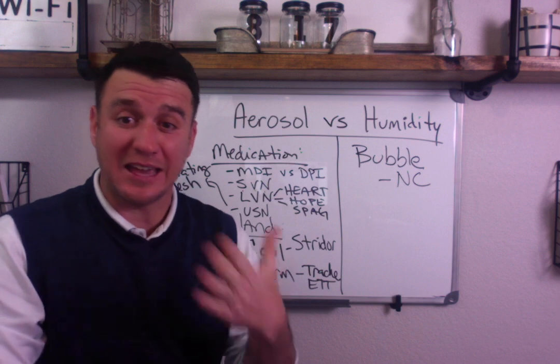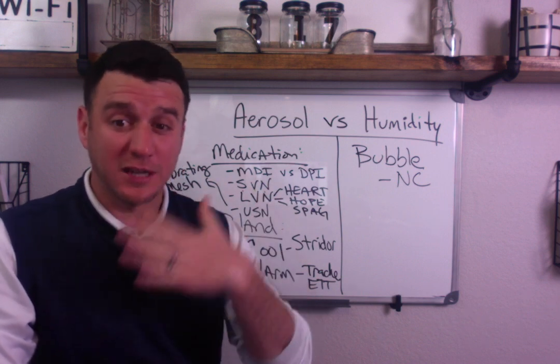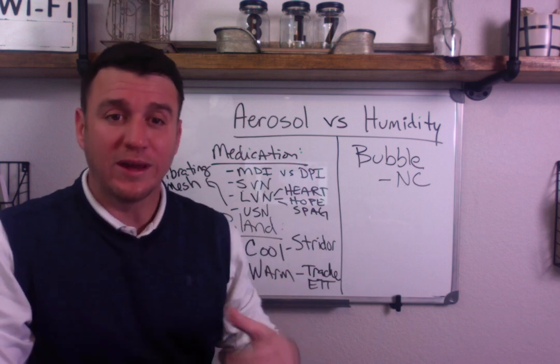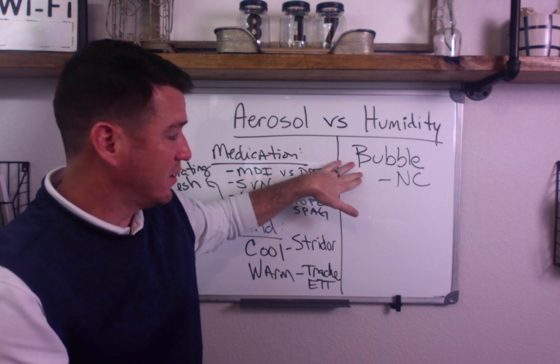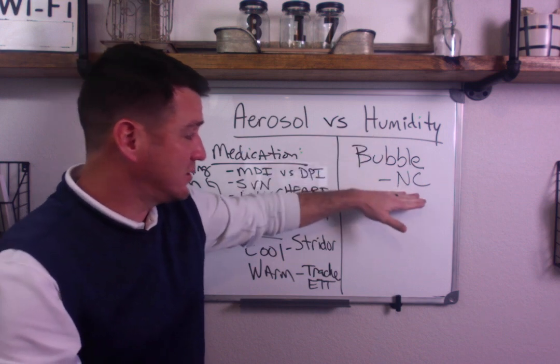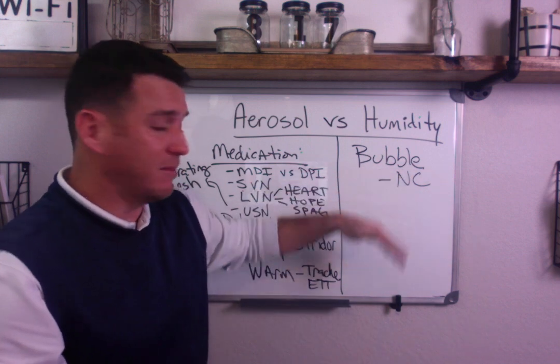And that's because that gas that they're breathing is dry. So it's causing upper airway dryness. We can alleviate that with the use of a bubble humidifier. Okay, so nasal cannula, your patient's complaining about upper airway dryness, think bubble humidifier.